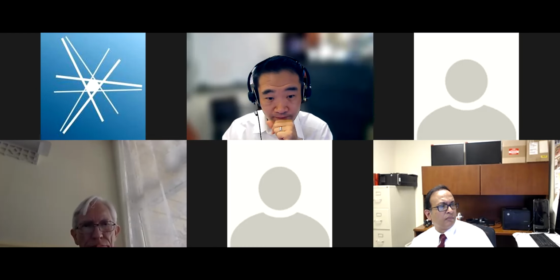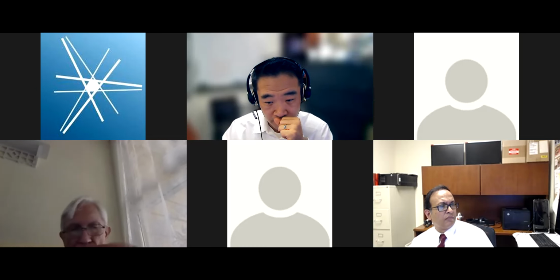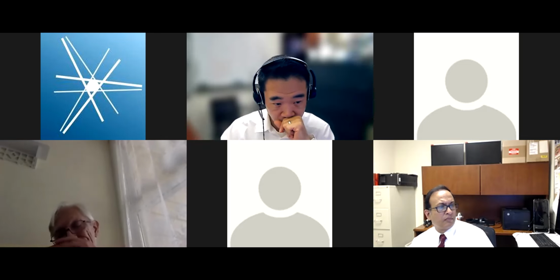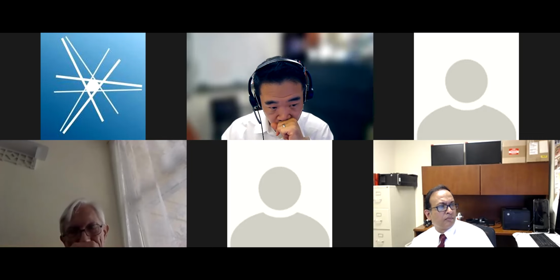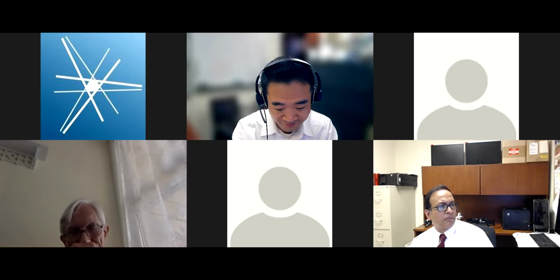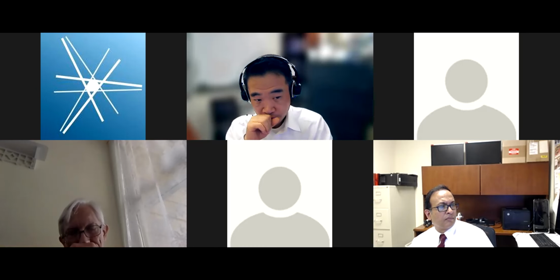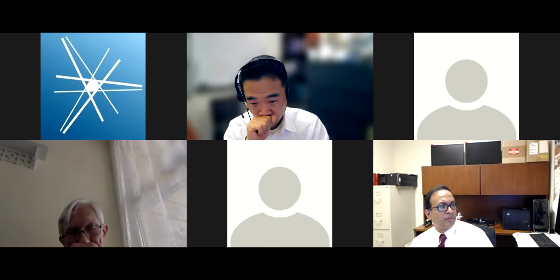Can I ask you gentlemen a question? Sure. If you were building a brachy planning system, what would be your top 10? What do you guys want to see in a program like this? And shoot for the moon. Tell me what is the best thing, or what you would like to see that's different than what's out there, or what would make life easier? Because these suggestions are great for us to actually try to get this stuff in there for you.